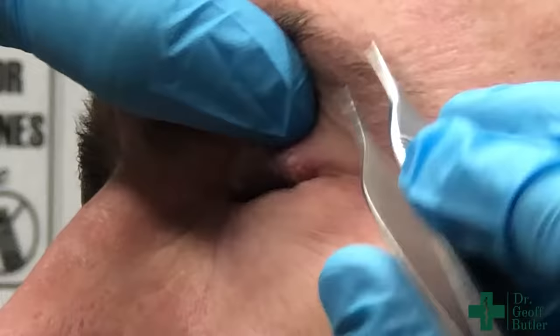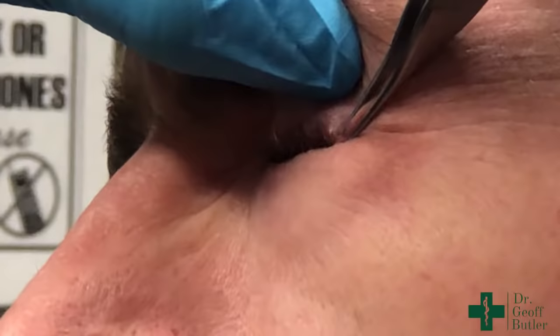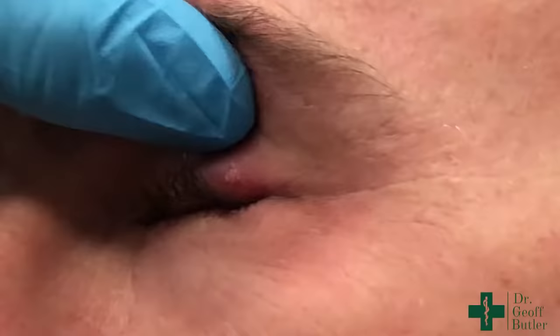So this can actually drain a bit more. As long as we can get it open — just like that. You should be able to see the difference; see how it's not as swollen now.